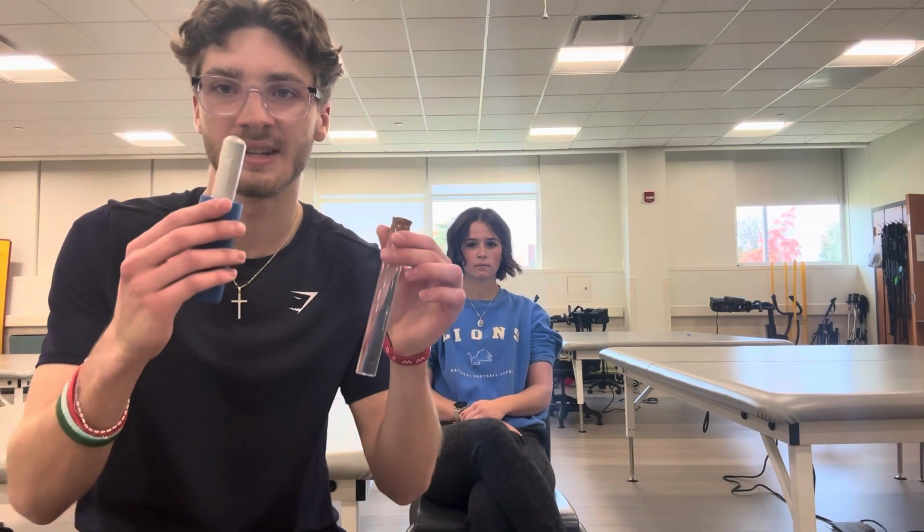Today we're going to be demonstrating cryotherapy techniques. The first part for any cryotherapy application is sensory testing. Specifically, we will want to be testing hot and cold sensation.